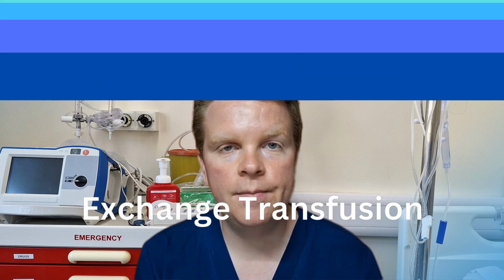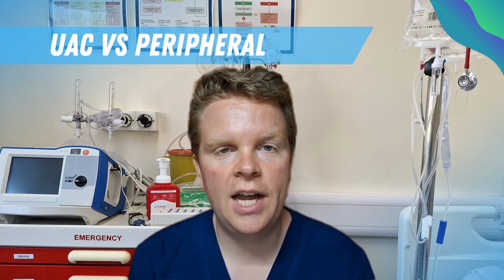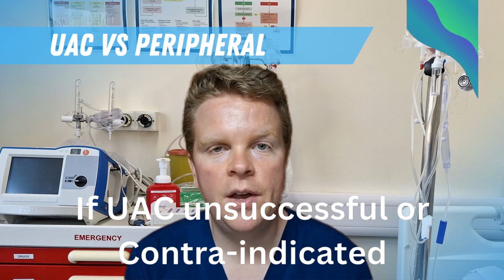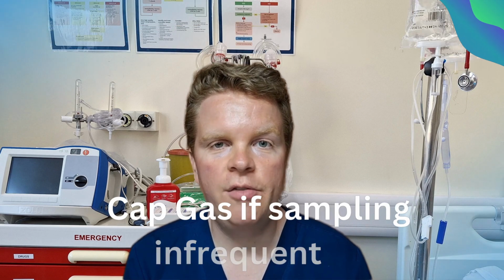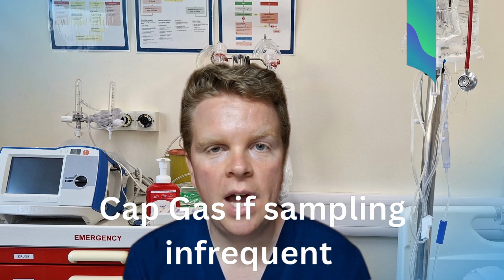As mentioned, umbilical arterial lines are often easier to put in than peripheral arterial lines. However, if these are unsuccessful or contraindicated, a peripheral arterial line should be attempted. For babies that require single or infrequent blood gas sampling, capillary sampling should be used. I have linked my video on capillary blood gas sampling at the top of this video.